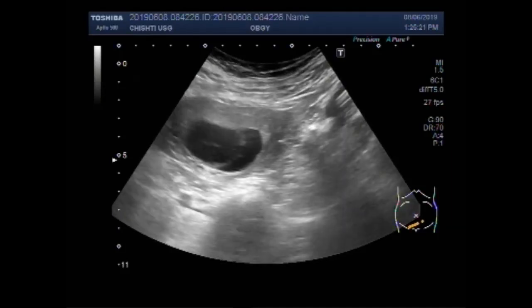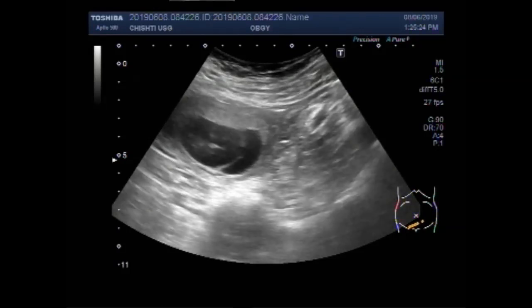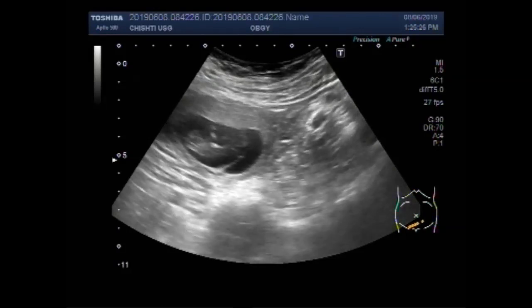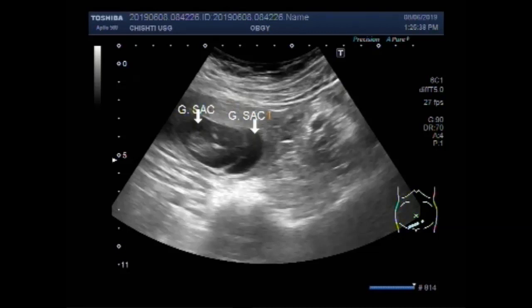And now you can see the other gestational sac, which is empty. There is no fetal pole or products of conception visible in it. This is the empty gestational sac with no fetal pole — that is a blighted ovum.